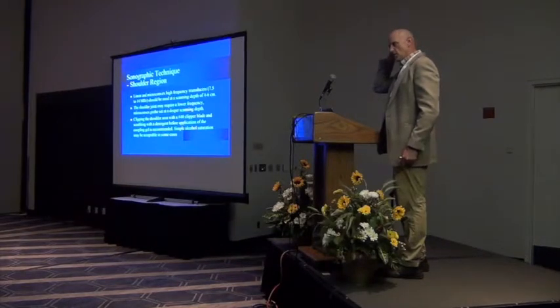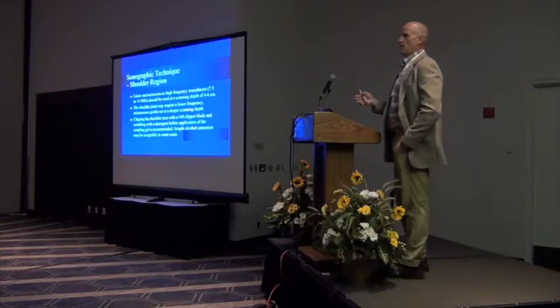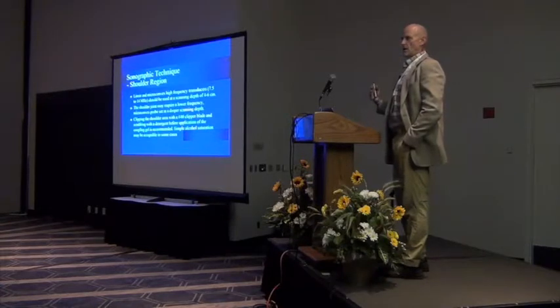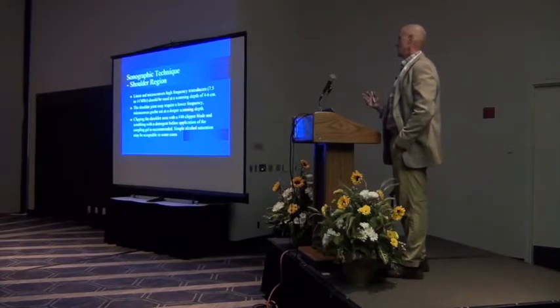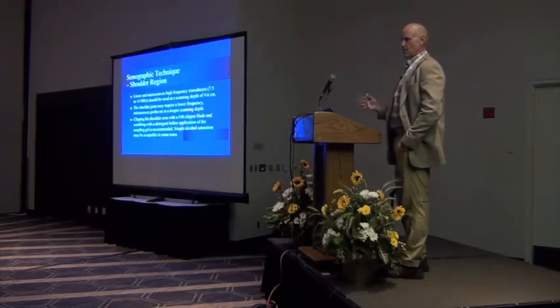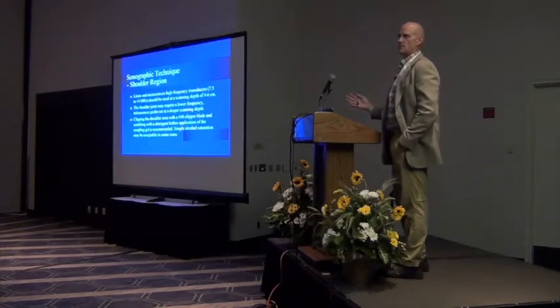Now, the other thing that I like to do as well is if I have an acute injury, I want to come back pretty quickly and scan it again, particularly on the lower limb with a tendon or ligament injury. I did a project at the racetrack where I was using Adequan in acute injuries of the superficial flexor tendon. I scanned them every other day for a week, and then I came back in 2 weeks. Maximal lesion size on those horses wasn't happening until 3 weeks.